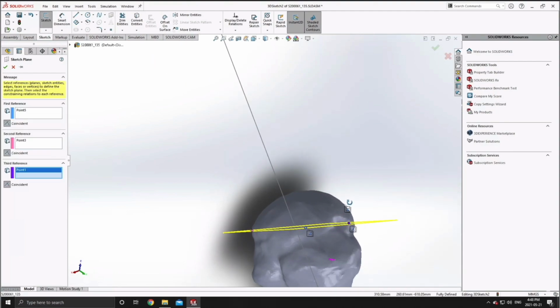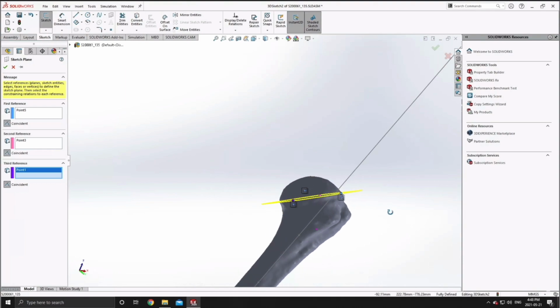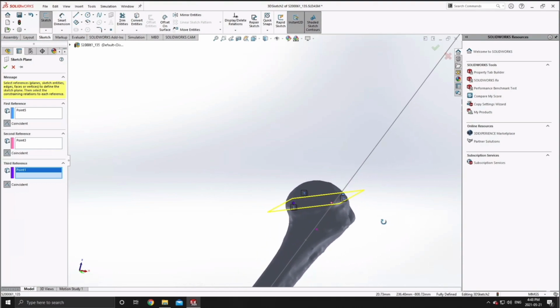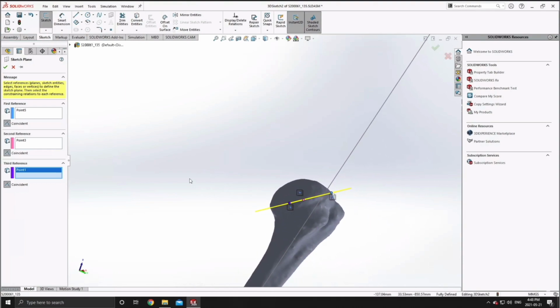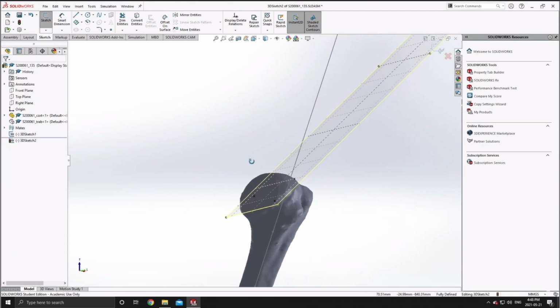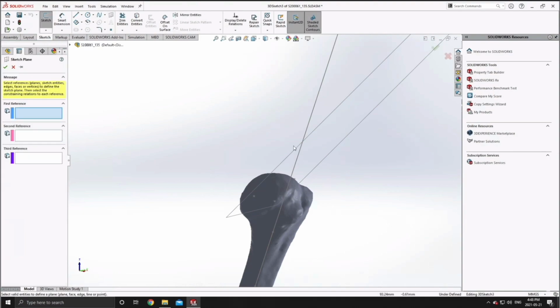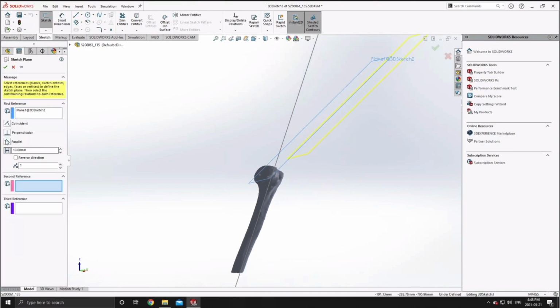So now that we've determined our degree of retroversion, we can begin to isolate our lateralization and neck shaft angle for our resection cut. Although this process is usually performed using a cut guide, and it's a little bit more arbitrary in the surgical suite, you can see that it's important to at least try to incorporate as much analytical ability as we can in the context of staying consistent, especially between patient models themselves.